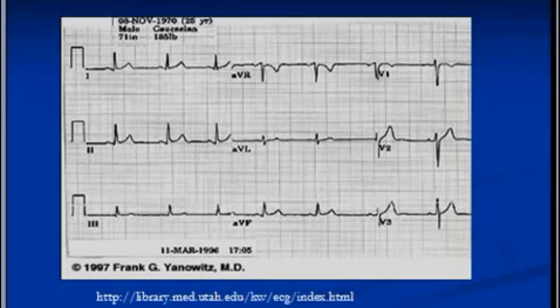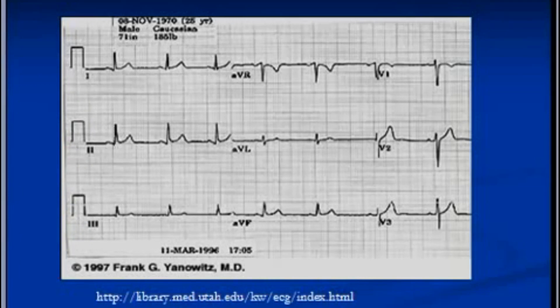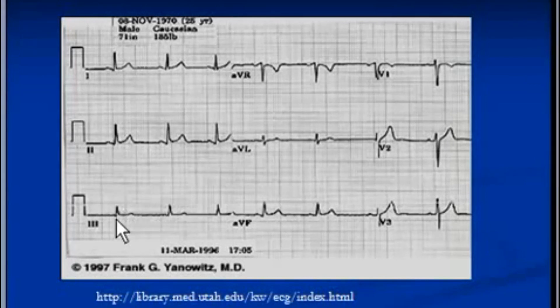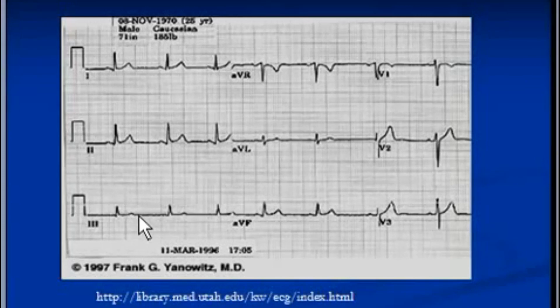This ECG does not show S1, Q3, or T3 pattern, but I just wanted to show you lead 1, lead 2, and lead 3. If it were to show an S1, Q3, and T3 pattern, you'll see a prominent S wave in lead 1 here. In lead 3, you'll see a prominent Q wave here, and this T wave will be inverted. So that is S1, Q3, T3 pattern.